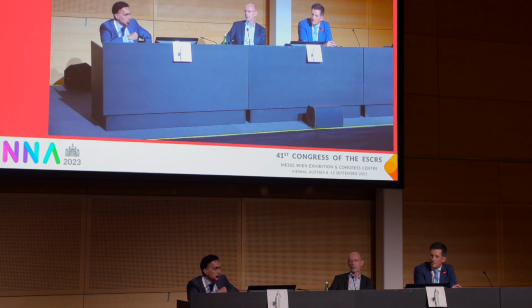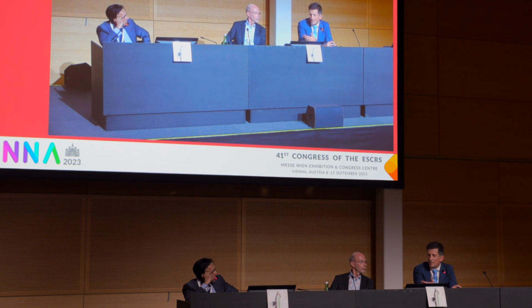As you mentioned, in a clinical study we always go for perfect healthy eyes. But this is, to be honest, rarely true in daily clinics. When we have patients with corneal issues, retinal issues, glaucoma, or dry eye. In our patient population, this was a cataract population, so these are older patients, not very young. The likelihood that in this patient group we find other diseases like dry eye, which is important of course, would probably change things.